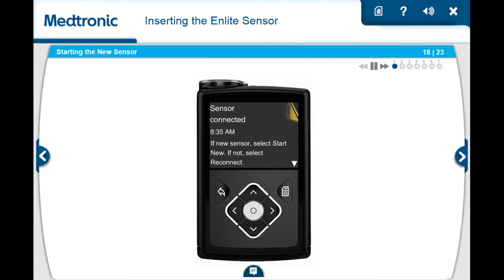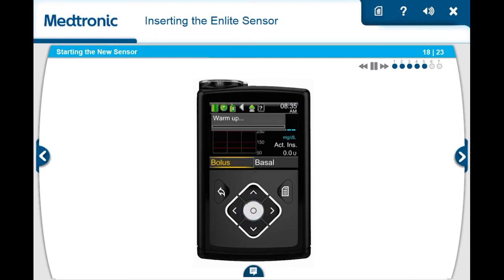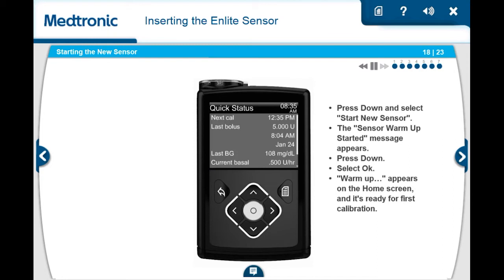Now that the sensor has been inserted and the transmitter has been connected, the pump and transmitter will begin to communicate. When the sensor is ready to be started, your pump will show the sensor connected screen. Typically, the screen will display in less than a minute, but in some cases may take up to 10 minutes. Once the screen appears, select Start New Sensor. The pump will display the sensor warm-up started message. Press the down arrow, then select to clear the screen. Your pump will go back to the home screen and will show warm-up until the sensor is ready for the first calibration. If 15 minutes have passed and the warm-up bar does not appear or it looks like it is not progressing, look in the Quick Status screen. If you see the time of Next Cal listed, the sensor is in warm-up.